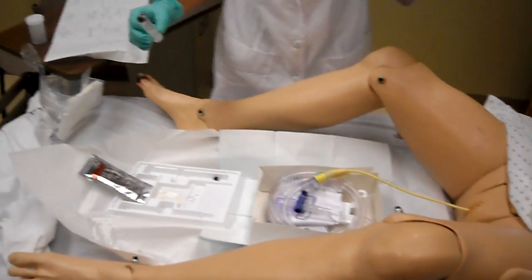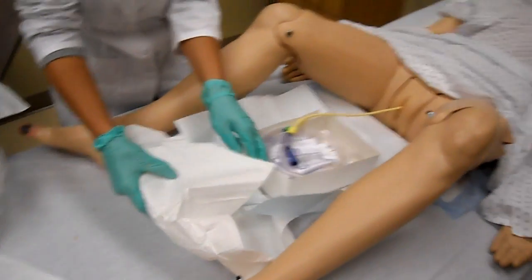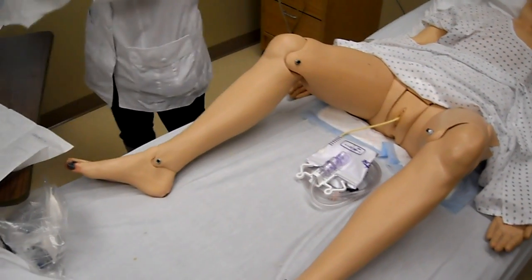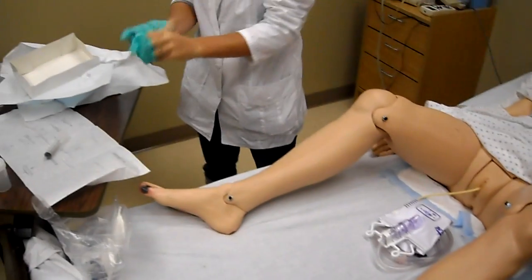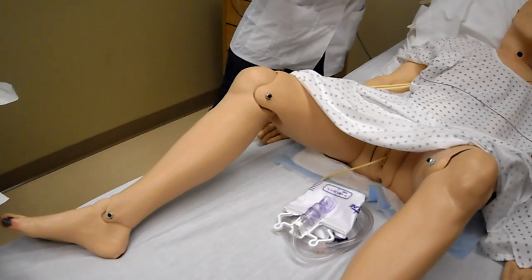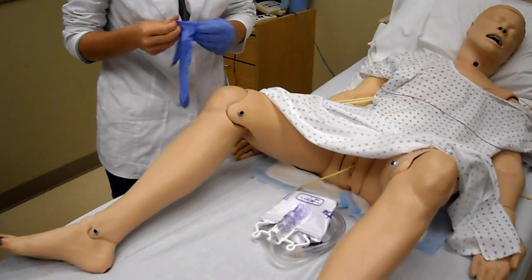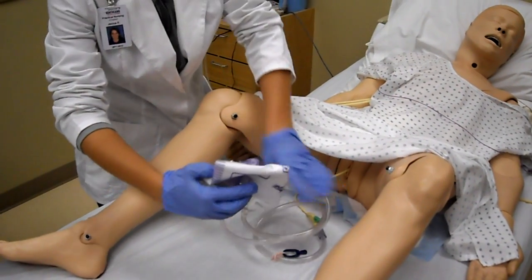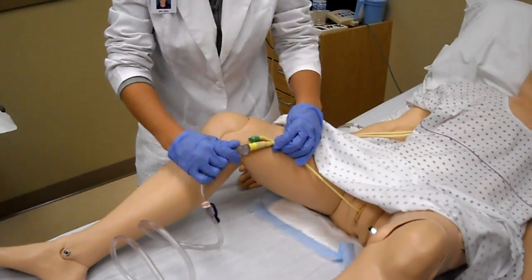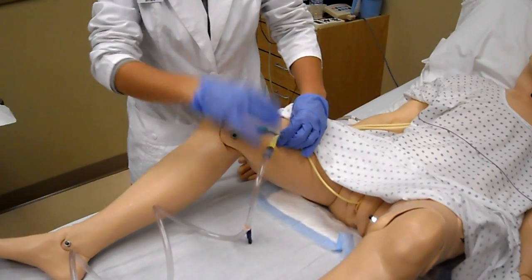Take that off. You can keep your sterile gloves on and clean up your field. Keep the bag out and dispose of items properly. At this point, take your sterile gloves off and throw them away. Make sure the patient is covered up, then put clean gloves on. Secure the catheter to the patient's inner thigh, loosely secured with tape or a catheter secure holder, so they can freely move.